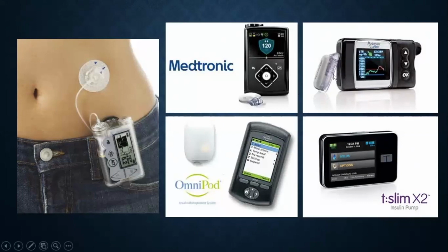The Animas pump, patients are still in clinic with this today, but Animas is no longer on the market. And then also the Tandem T-Slim, which is the only touchscreen pump here on the market so far. So these are all of the controllers, so the actual insulin pump, if you will, where patients make decisions and input information to control their insulin levels that are being administered. So how does that do that?